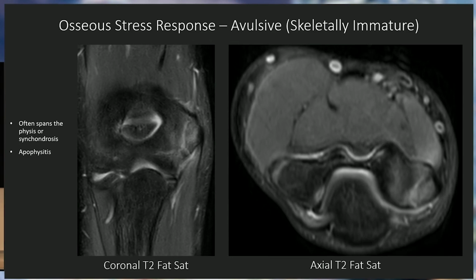And you also mentioned a specific thing called a tug lesion, which can be misinterpreted as a bone lesion. I was hoping you might go through that for listeners and just define the differences and how that works. Yeah, so epiphyses and the physis can be challenging to interpret, especially if you're not frequently seeing a moderate to higher volume of these cases during your day-to-day routine.